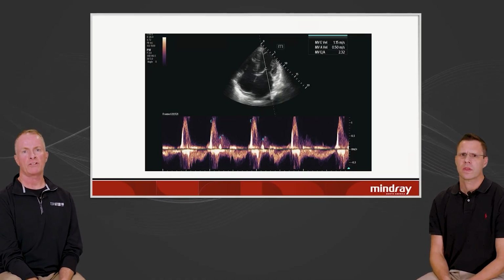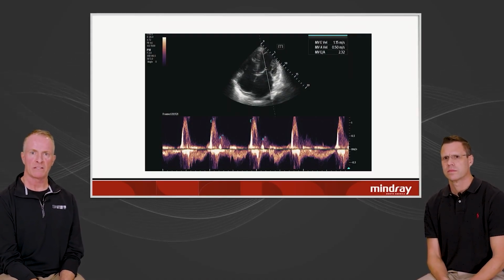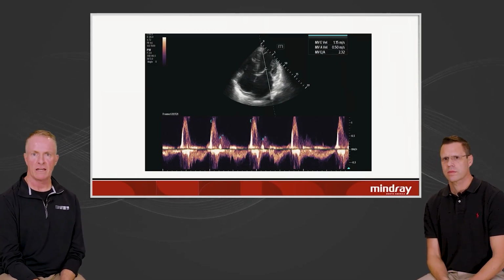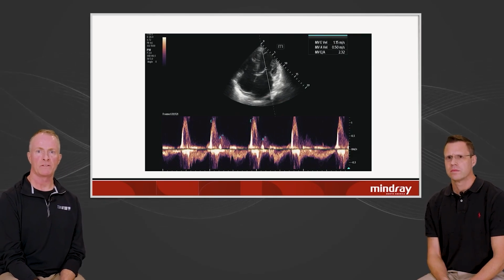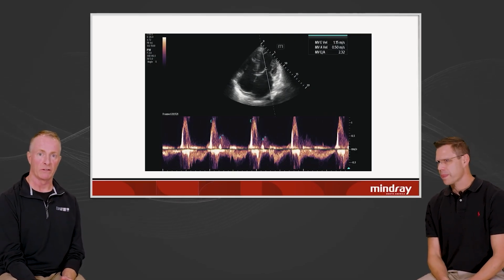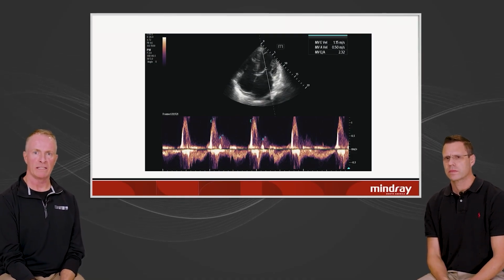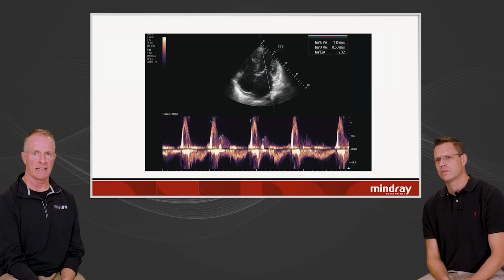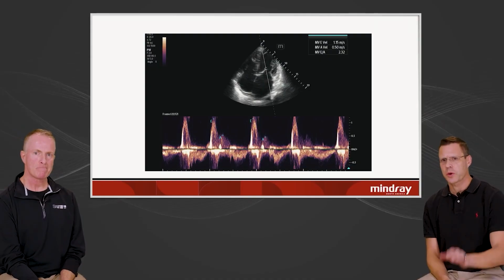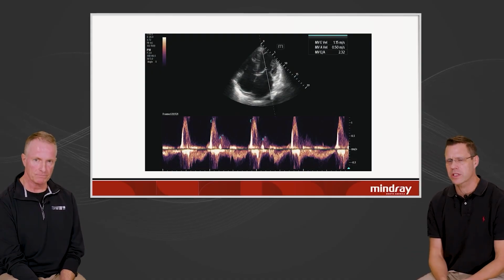So this kind of shows you the progression from normal to grade 1 early diastolic dysfunction, where you get a reversal of the E and A waves, to grade 2, and this is a confusing part, grade 2 diastolic dysfunction has a pseudo-normalization, so they re-reverse. And then you get to that one we just looked at where the E wave is towering over the A wave. That's late, or grade 3. And I think this is where you lose people a lot, when you go from your normal and your pseudonormal, because they look so much the same, and the hearts themselves may have a similar appearance.